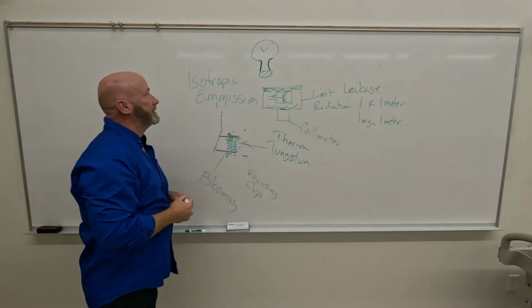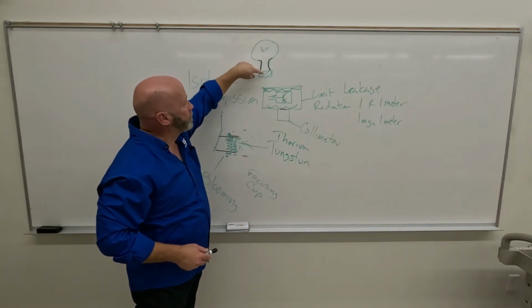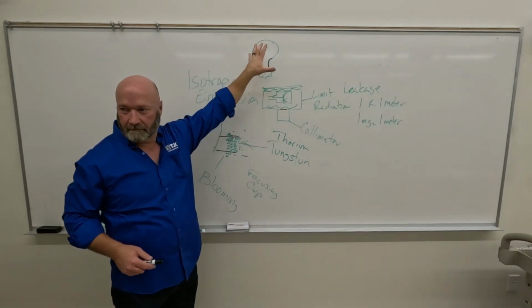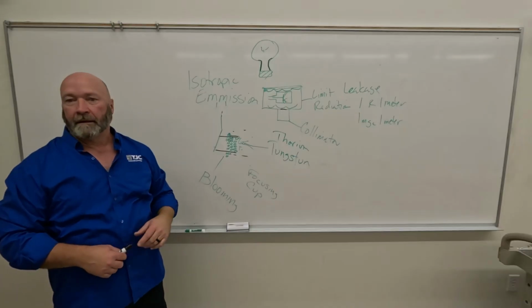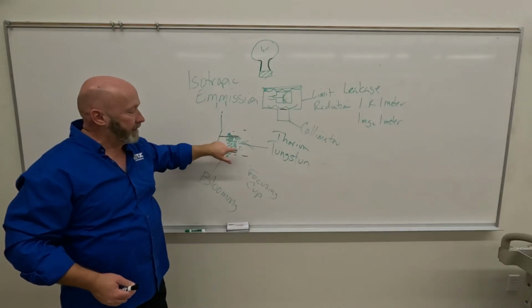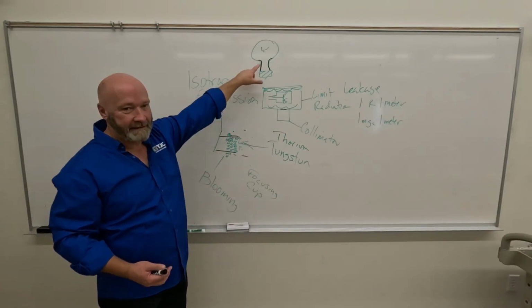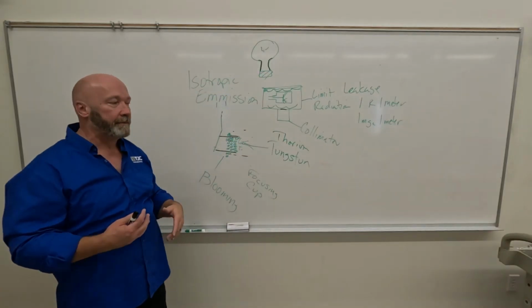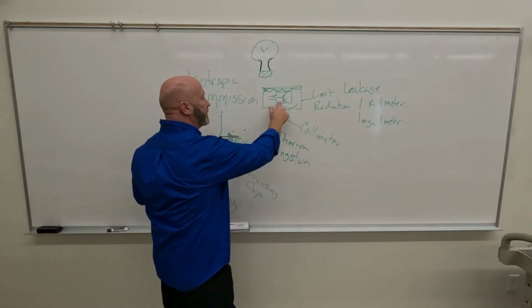That is part of that filament that comes out and coats the inside of that light bulb. Same thing happens in your x-ray tube. As you heat this thing up, every time you heat it up, and especially if you heat it up a lot, you're vaporizing the filament, and it's going to coat the inside of the x-ray tube.